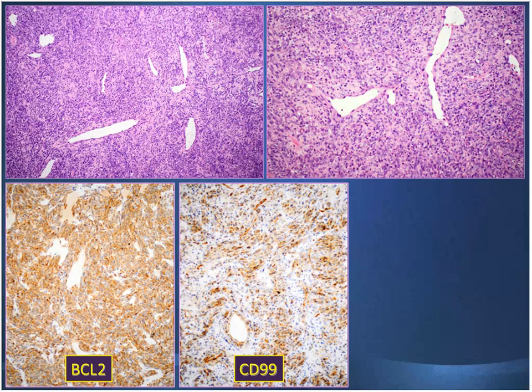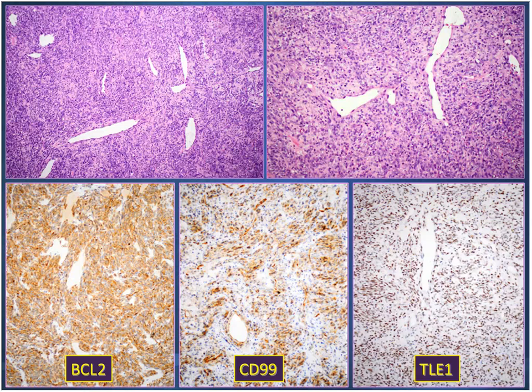These tumors can be focally positive for cytokeratin and EMA, and normally they are also positive for BCL2 and CD99. So that's where the question came whether this particular one is a synovial sarcoma, and TLE1 is positive in almost all the nuclei of the tumor cells. So this marker has helped me personally a lot in some of the unusual tumors in unusual locations, particularly in the soft tissue of younger adults.